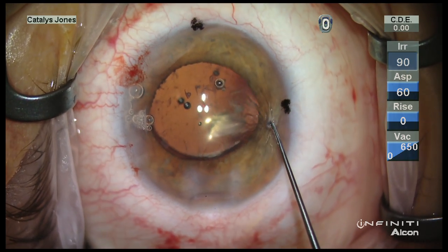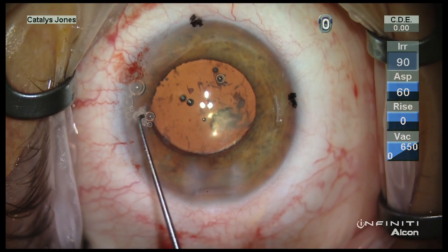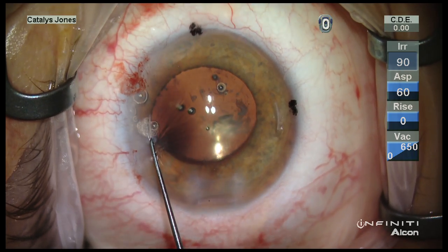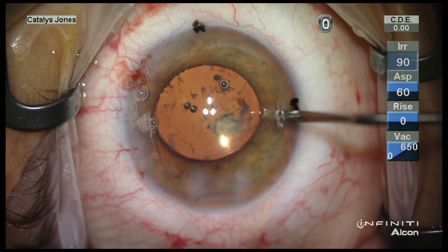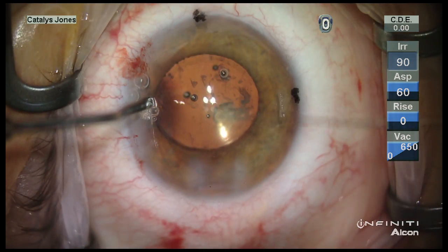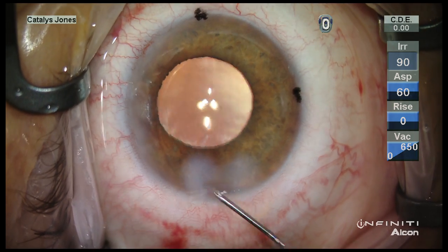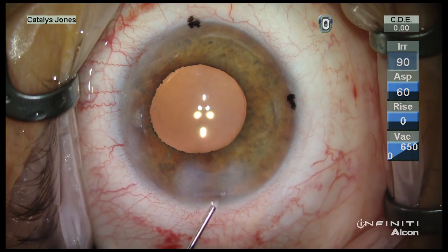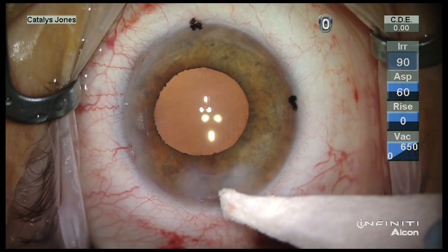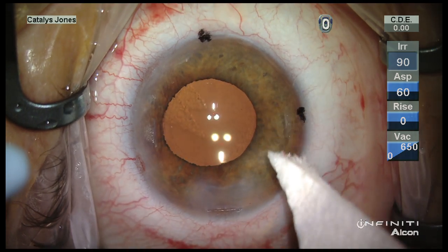With viscoelastic in the anterior chamber, each of the corneal relaxing incisions is identified and opened using a Sinski hook, and then I ensure adequate dissection using the spatulated dissector. The viscoelastic is then removed and the wounds hydrated and checked.